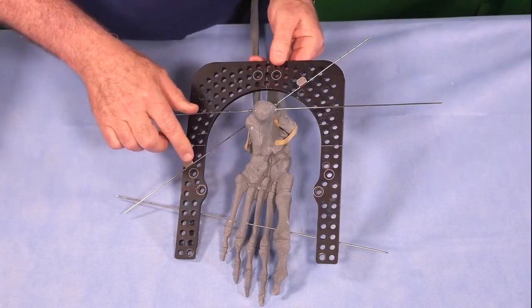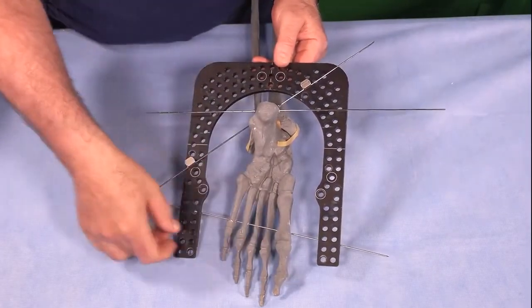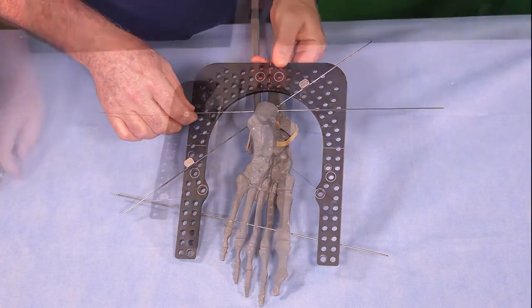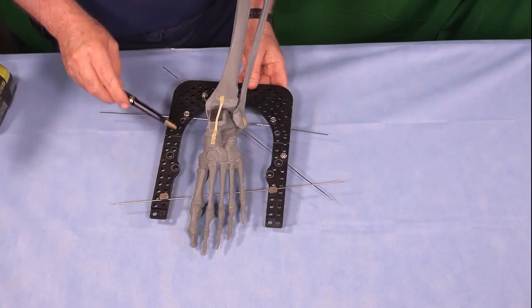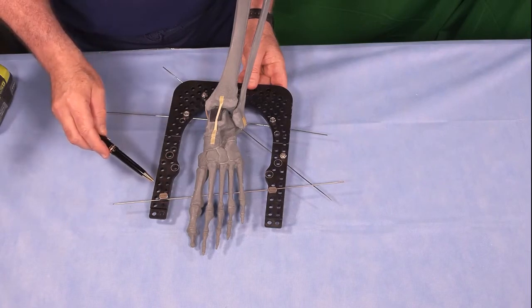So that wire rests exactly on the ring. This wire is going to rest on the ring. I can add one directly. This one's directly on the ring. For this one, I'll have to add some washers. At this point, I've attached the 3 wires to the frame. I haven't tensioned them yet.